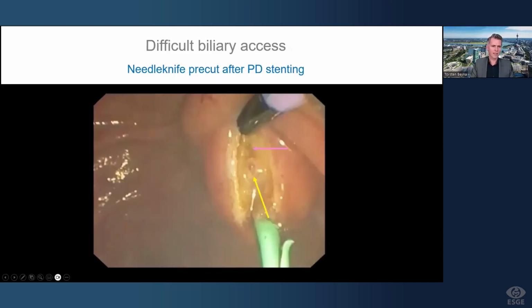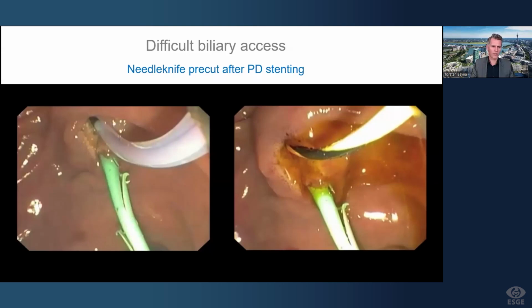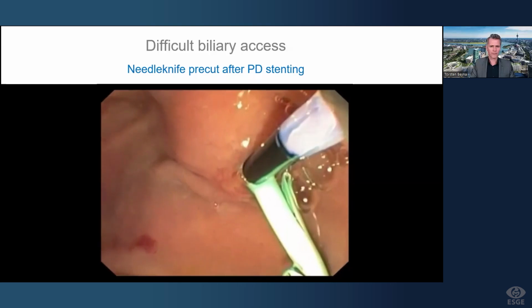Let's see here. So this was after the first cut. We can already nicely observe here the anatomy. So we can here see a little opening, and we can see here muscle fibers that usually derive from the anterior wall of the CBD. So let's see here. So here one more cut, just very gently cut here into the biliary direction. Then we can see here a small opening, and after that we can do a deep cannulation. Let's see again in a video the same patient here again.